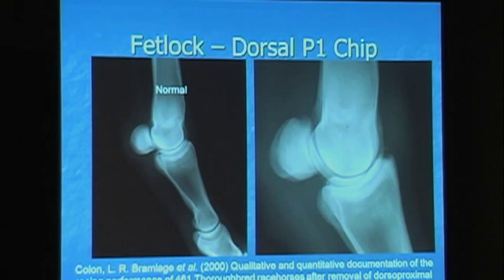So this is the fetlock joint. Here's the cannon bone. Here are your sesamoids. This is P1 or your long pastern bone. This is your fetlock joint — this is normal, the screen on the right. This is a dorsal P1 chip. You can see right here this chip of bone.